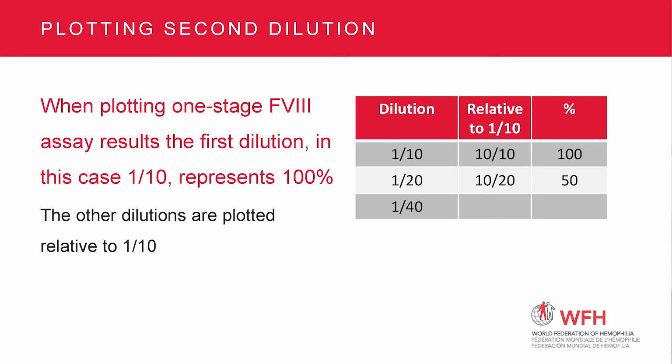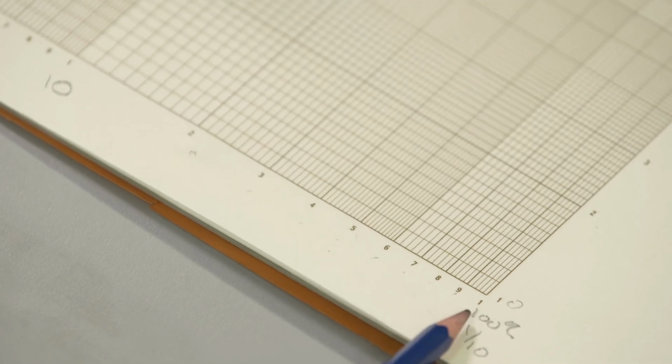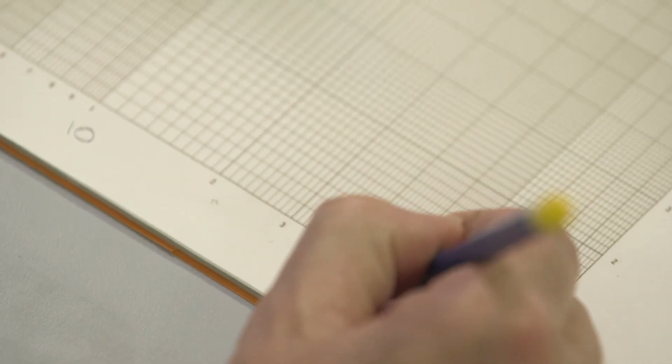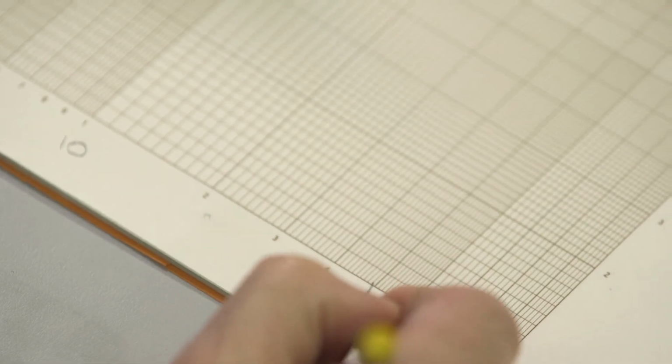The second dilution, 1 in 20. Where do we plot this? The first dilution, 1 in 10. The second dilution, 1 in 20. So the concentration in the second dilution is 10 over 20, 50% of the standard. It's 10 over 20 times 100, 50%. So we go along the bottom, 100, 90, 80, 70, 60, 50%. So the 1 in 20 dilutions will be plotted in this area.